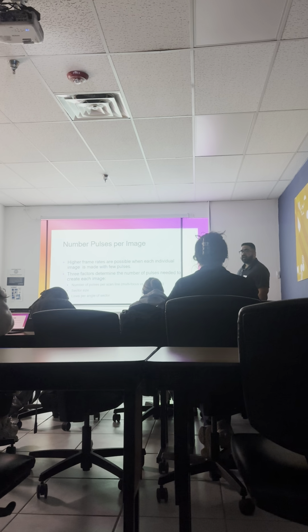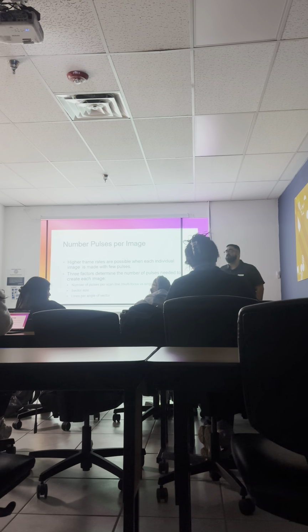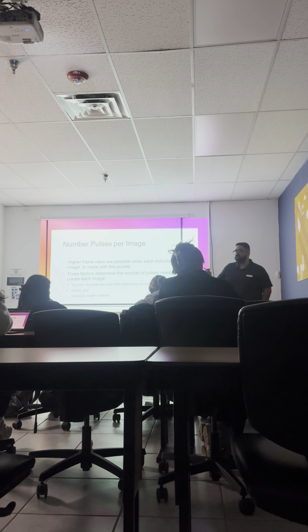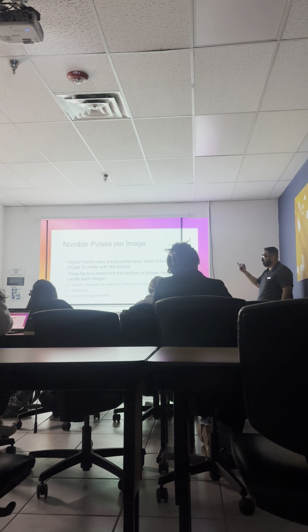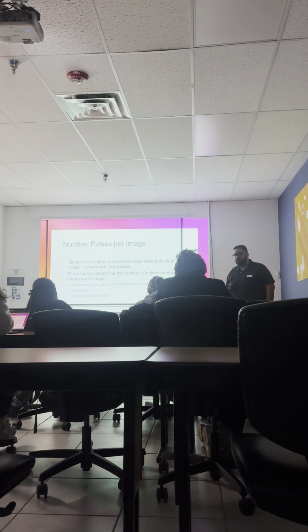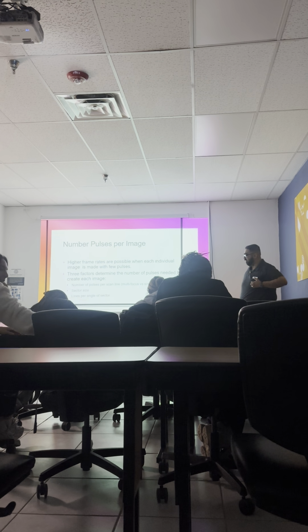When we want a higher frame rate, right? And when do we want a higher frame rate? When we're tracking movement of a moving structure such as a heart. Okay, now, when is it okay to have multiple pulses per scan line to help our image look better? When something is stationary, right? So we don't have to track the movement. We don't have to show that the structure is moving at a certain velocity, right?